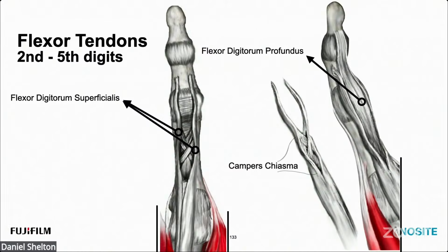but it's important surgically, I guess, if you need to see where the vinculum and the little neurovascular structures, basically the arteries that pierce and feed the flexor tendons, travel through this network here, and it's called Camper's chiasma. And I think of campers as, you know, if you're going camping, this looks like a hammock that sits across the two heads as they divide, and we'll see that in the live scan.